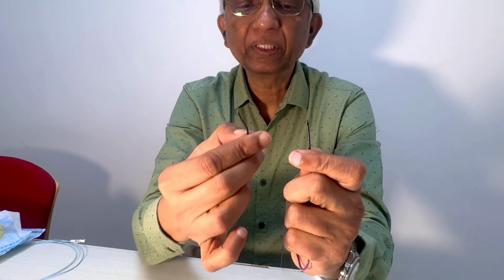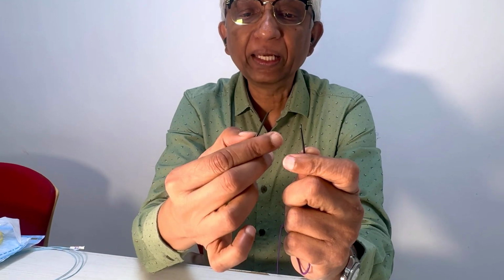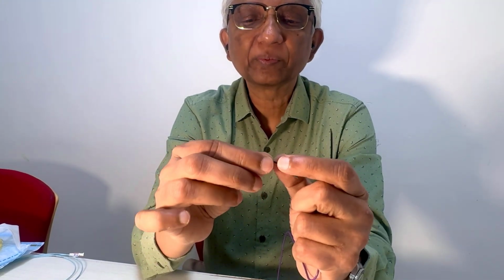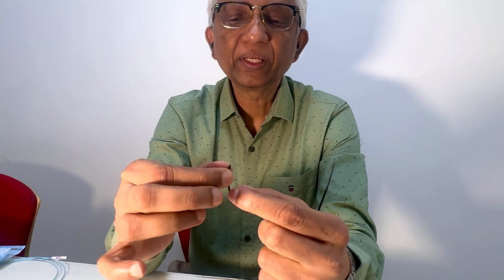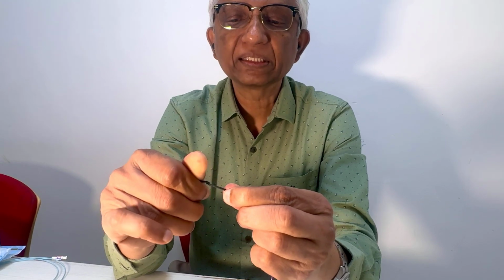I want you to remember this extremely important point, that this catheter can break, and once it breaks, it's a disaster. It's difficult to take out this piece. Just have a look. These tip pieces are so flimsy, you can break it just with this much pressure. So remember, when you're knotting it around, it's a disaster. You'll knot it, you'll break it.